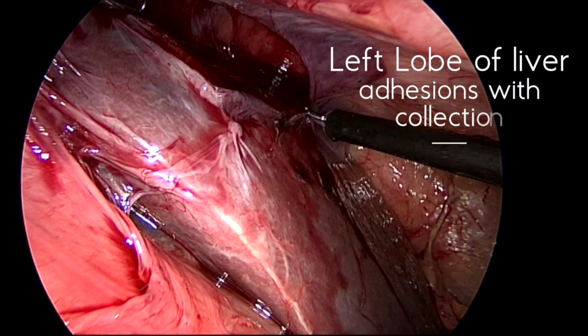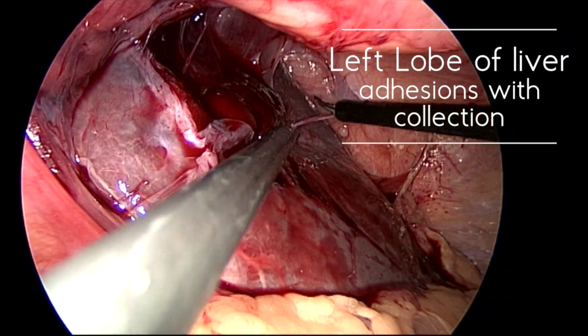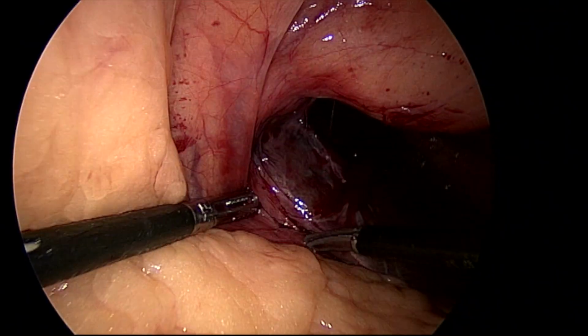This is the video of laparoscopic cholecystectomy in grade 3 acute cholecystitis. And you can see here the left lobe, a lot of adhesions, and there is a collection in between the adhesions. The entire upper abdomen is like a mass.